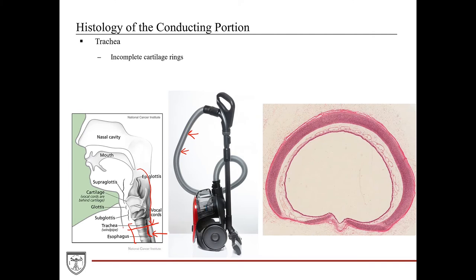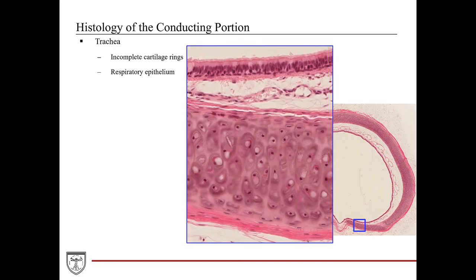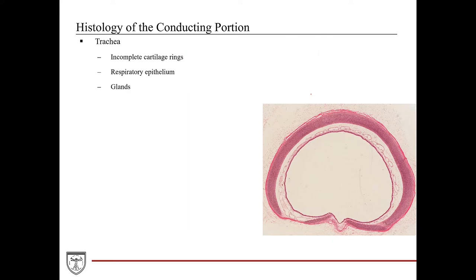A cross-section through the trachea shows the anterior and posterior aspects. The eosinophilic structure in the middle is the hyaline cartilage, which does not form a complete circle — closing that circle is a small bundle of smooth muscles. At higher magnification, the luminal lining is comprised of the respiratory epithelium — the ciliated pseudostratified columnar epithelium with cilia and goblet cells intermixed. Underneath is the lamina propria, and deep to that is the cartilaginous support — hyaline cartilage with its perichondrium.